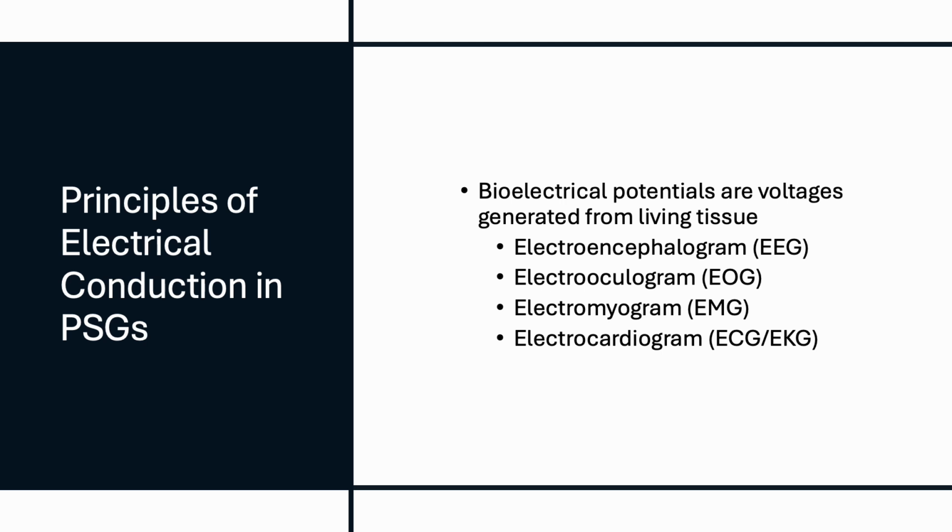The first kind of electrical conduction is the actual electricity coming off of the patient. This means we can slap a wire over something along the electrical pathway of the person, or the signal pathway, to detect when electrical impulses occur. And that's a very simple way to put it. And we'll go on later about how different signals one wire can pick up and how to record just the waves we want.